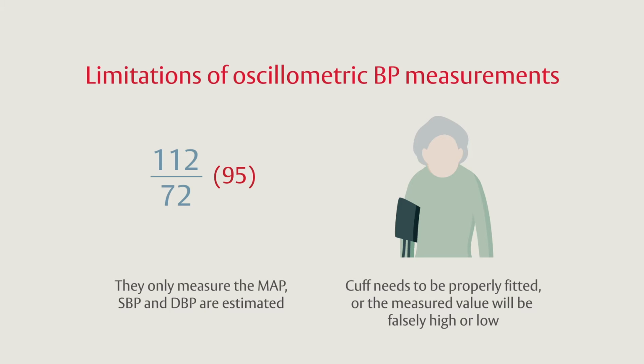At both very low and very high blood pressures, the readings from an oscillometric blood pressure cuff are less accurate. When the blood pressure is very low, the oscillometric cuff is likely to incorrectly overestimate the blood pressure, and at higher values, the cuff may inaccurately underestimate the pressure. Though they can cycle intermittently, blood pressure cuffs cannot practically measure pressures any more frequently than about every 2 minutes to avoid injuring the limb being measured.